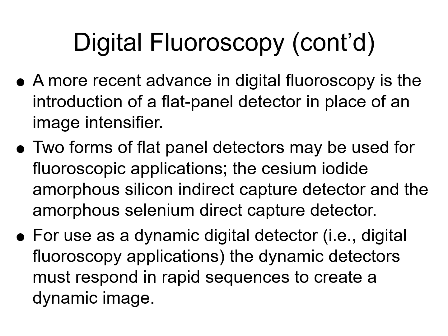For the dynamic digital detector, you just need faster readout and faster on-the-fly processing of the image. You beef up the readout and processing electronics for a fluoroscope, and it is able to broadcast the images in real time, rather than like on a digital flat panel plate like the Canon plate, which takes about 2 seconds to get the flat panel image. We just beef up the software and readout electronics and make them quicker.